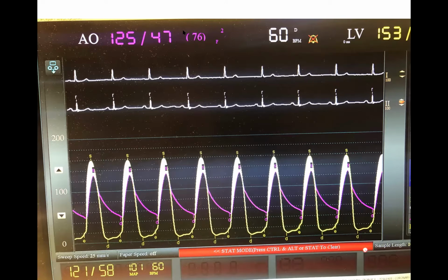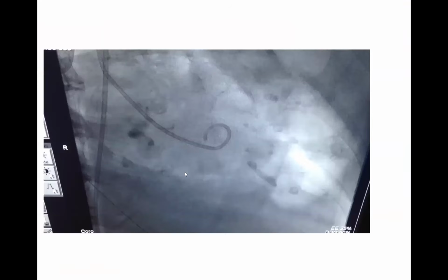Maybe since a lot of you are still here, I will explain another point, how to measure LV aortic gradient. One way of measuring it is having a double lumen pigtail, basically a pigtail that has 2 catheters side by side, attached to each other. One catheter finishes in the LV and another catheter tip finishes in the aorta.